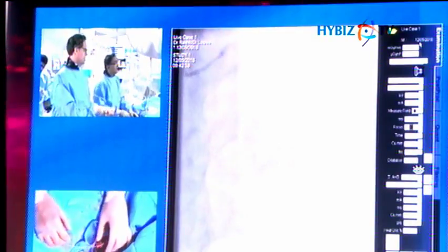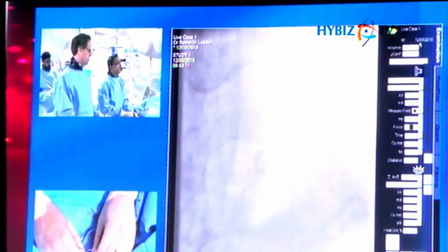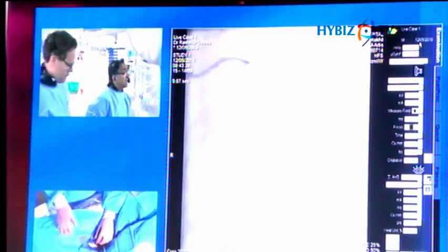Big panel, yeah. And this is dilating nicely, actually, 18 with the 3.5. Take the device down. Let's just pull back and check flow. The ECG is pretty silent. Let's just do an acquisition. Off we go. Nice. So there's good flow, and I'm reasonably confident that the calcific part of the lesion has dilated well. Definitely.